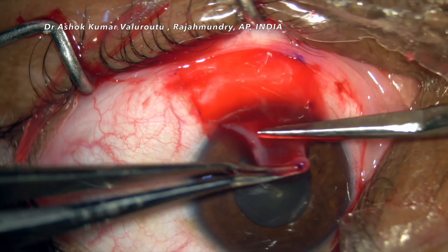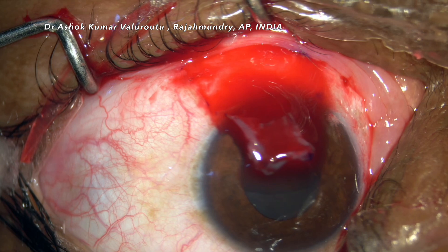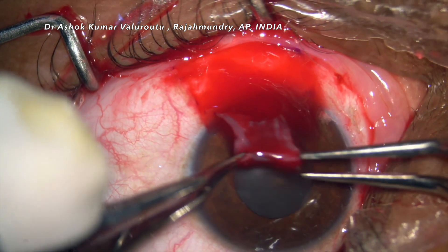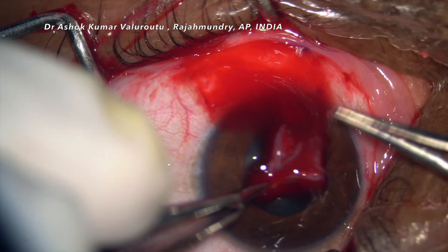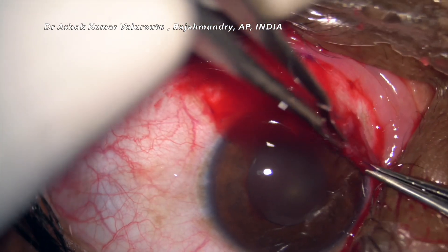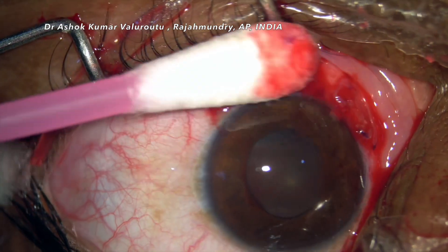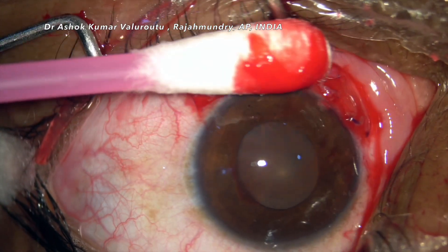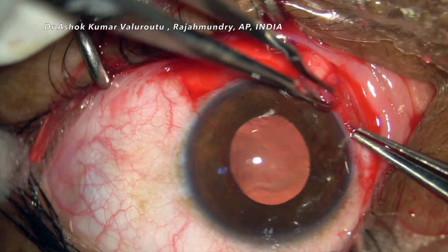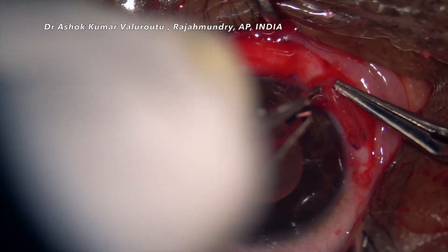We need to make sure that the limbus side of the graft should always face the limbus side of the nasal pterygium which we have extracted, so the bare area's limbus should be overlapped by the graft's limbal stem cells. This orientation is very important. We should also make sure the host area has no bleeding vessels — cauterization is generally not necessary, but if needed a mild cautery can also be done at the host area.